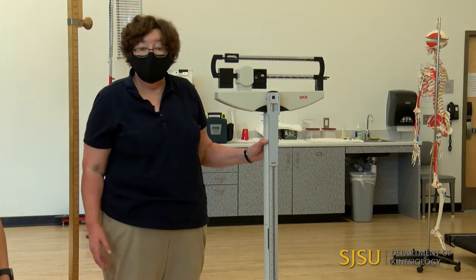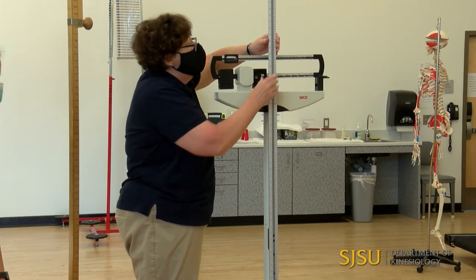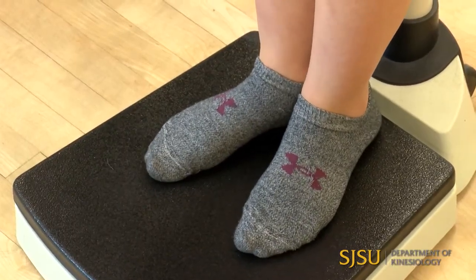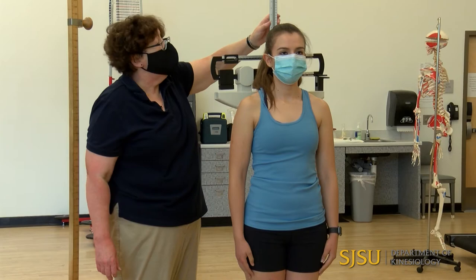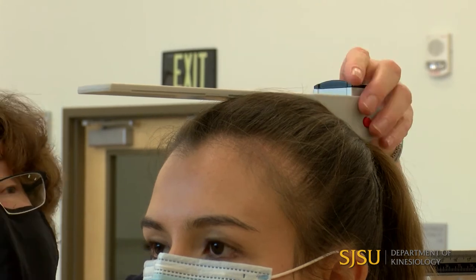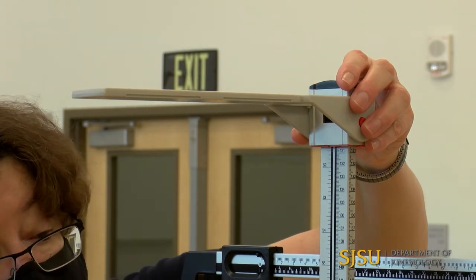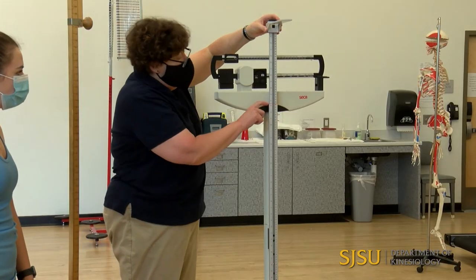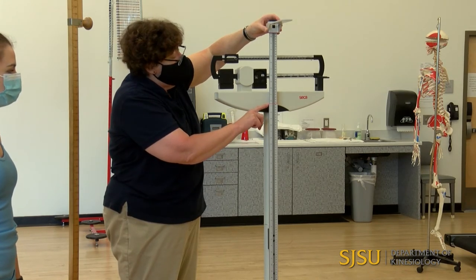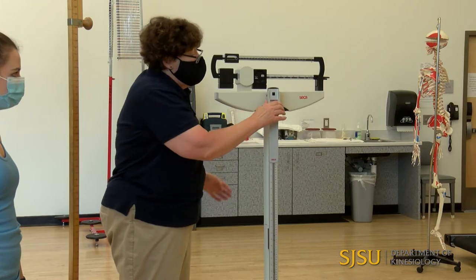We can also measure height using the physician's scale. Christina has her shoes off and she's going to step on, heels together, toes apart. On this one, she is not going to be able to push it up as she inhales, so I'm going to have her inhale now, put it right on the top of her head level, and she can exhale then step away. I can measure centimeters on this side, or inches — she's at 62 and three-quarter inches. And that's how we use the stadiometer on a physician's scale.